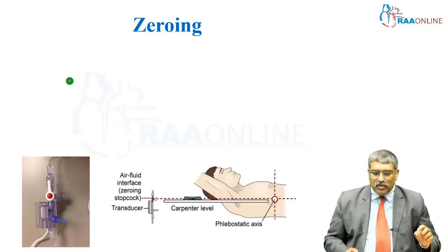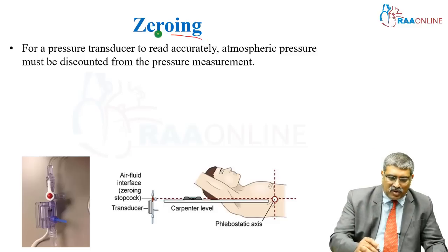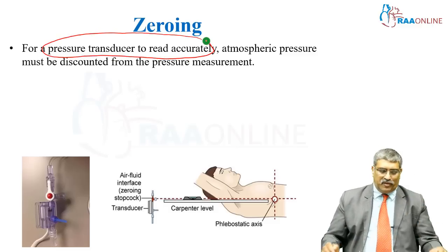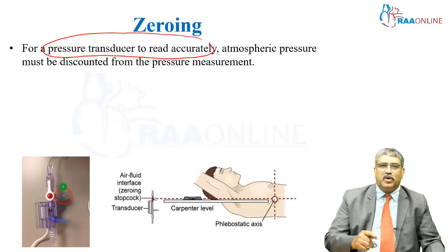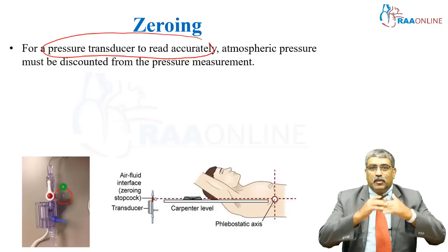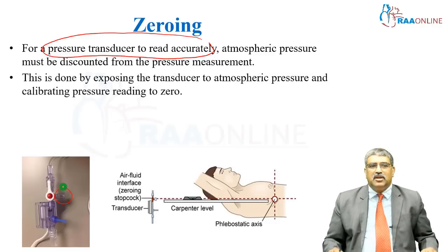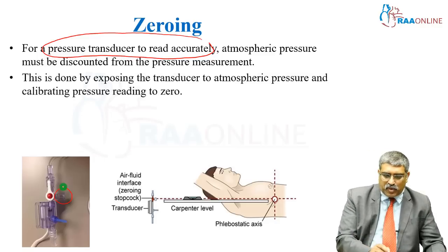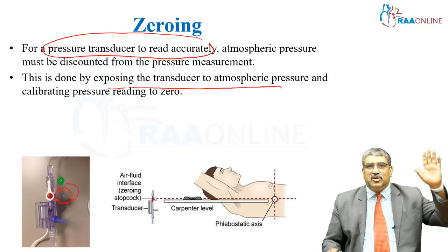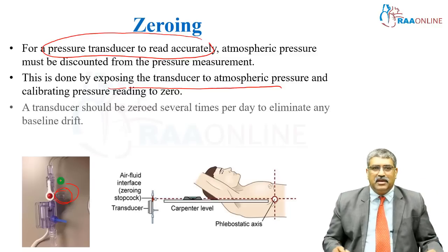For the pressure transducer to read accurately, you should discount the atmospheric pressure. You open to atmosphere and you flush the line and you zero it so that the atmospheric pressure is discounted from the central venous pressure. So, this is done by exposing the transducer to the atmospheric pressure and the calibrating pressure should show on the monitor as 0. That is very important. This is the first step.